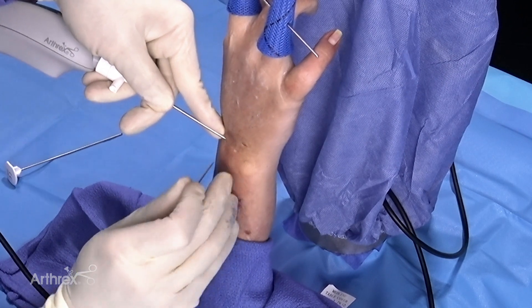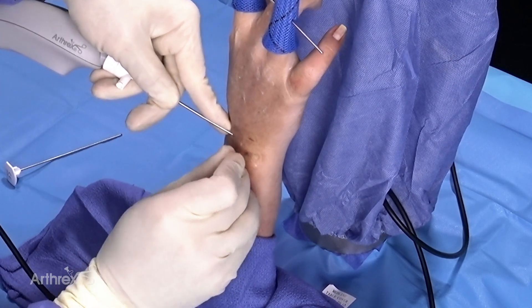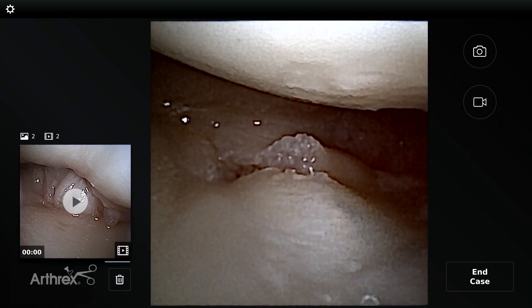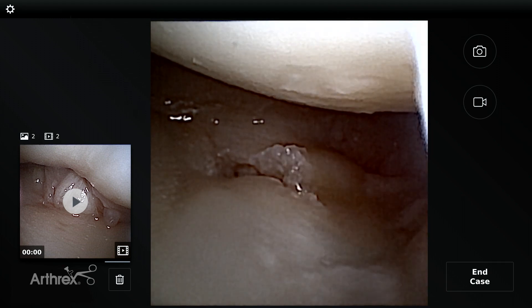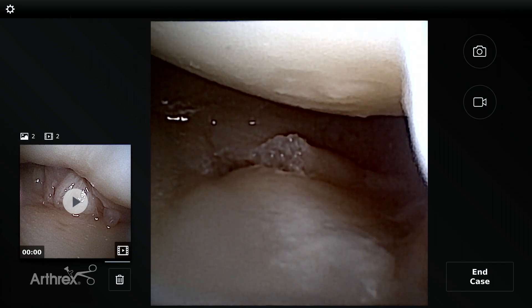We had a radial tear, and now what I've done is taken a needle — and you can see I'm underneath the TFCC. The nanoscope has given us the ability to get into a very tight spot with extreme accuracy, knowing that I'm underneath the TFCC. You can see the needle is now marking my portal for the DRUJ.